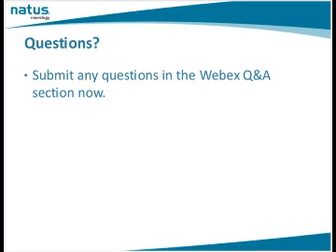First question is, when recording the MCA, we start at 50, go down to 40, and record and take pictures up to 60, then start recording MCA ACA at 60. Should we continue to get pictures above 50?